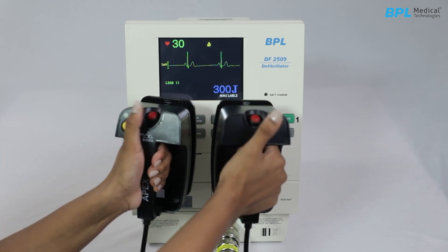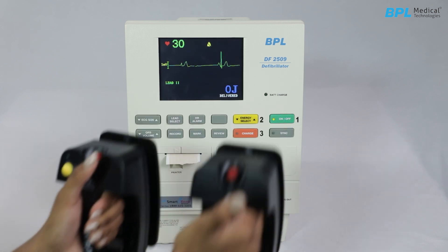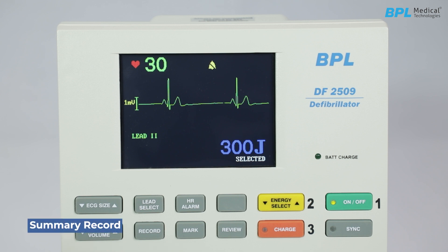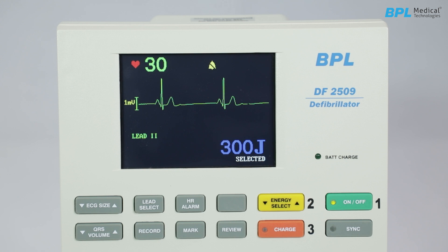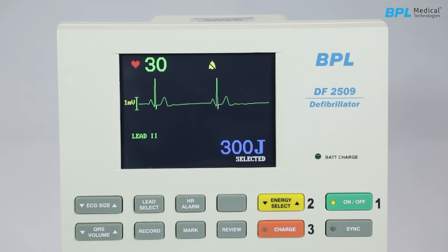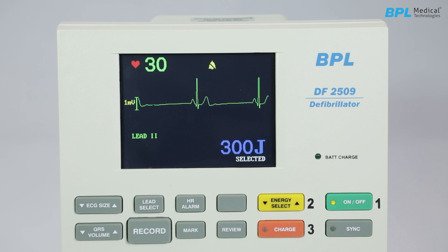Hold both shock keys on the paddle until the energy is delivered. Event summary record: the device stores up to 24 critical ECG events, each lasting 10 seconds — 7 seconds of post-event data and 3 seconds of pre-event data. No new events are recognized during this period. To print an event summary, press the Review key; all stored events will print. Press the Record key to stop printing. Event summaries can be printed even if the unit was switched off and later turned on.